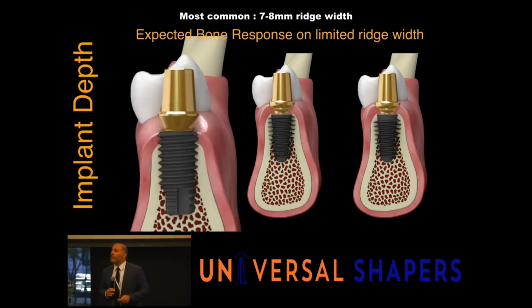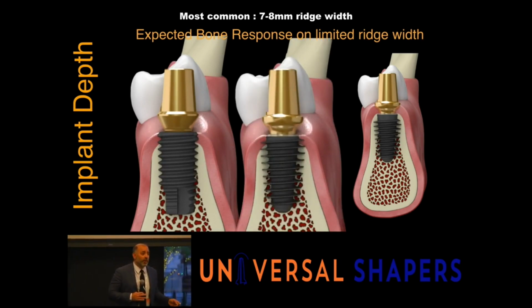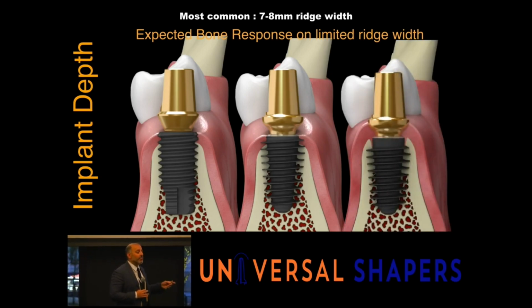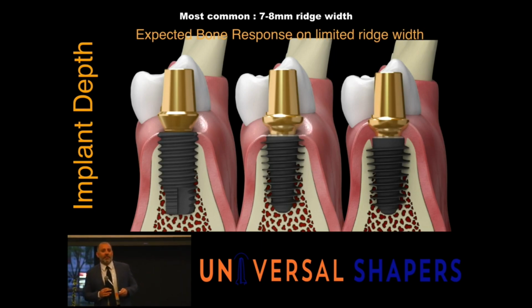So looking at these over time, we'll get more bone loss when we place it at the crest with less bone. An implant like that, again, the threads will start to get exposed. Once those threads are exposed, you know you have a nightmare on your hands. You have to start dethreading and augmenting. Whereas in another scenario where you get the dieback, the threads are not exposed yet. And we may get some type of a long junctional attachment that may form around it, or what we like to call a col, C-O-L, effect around the implant. So this is kind of what we expect with these type of implant designs.